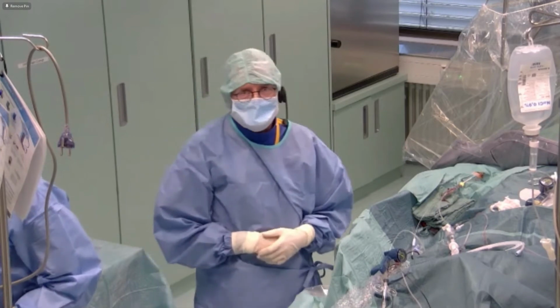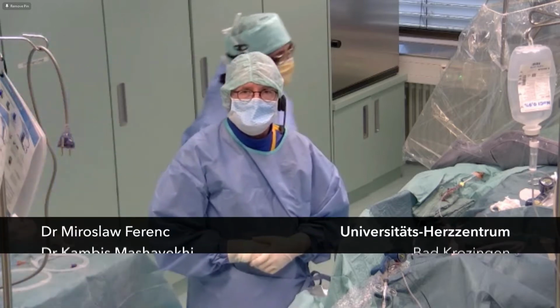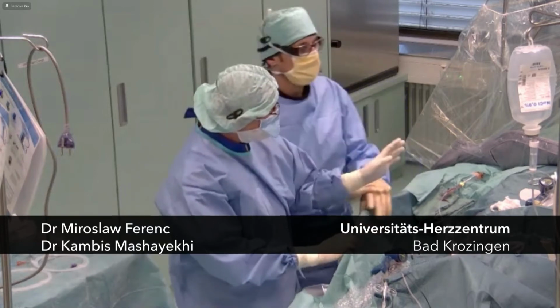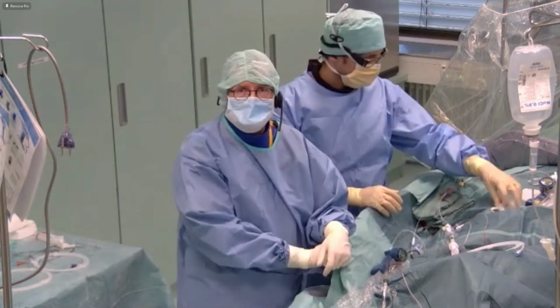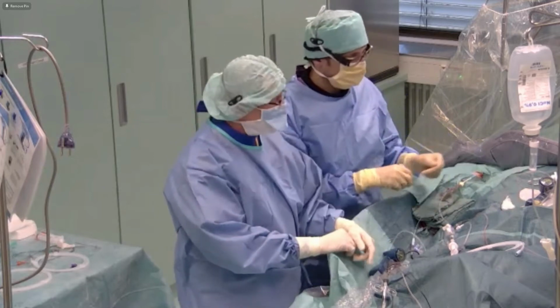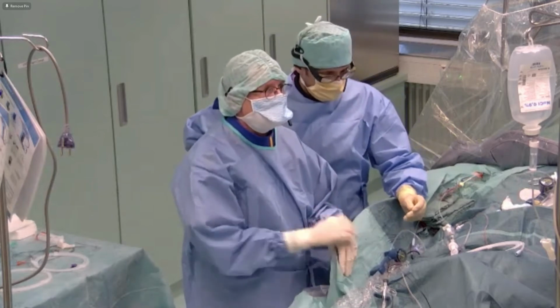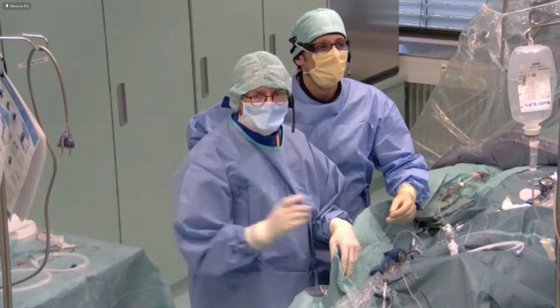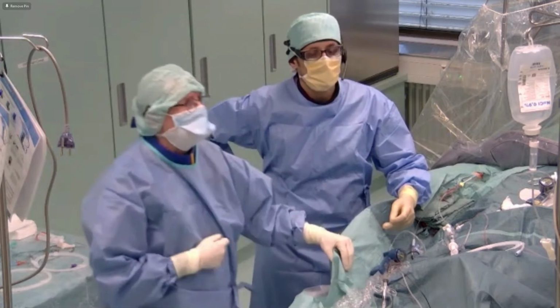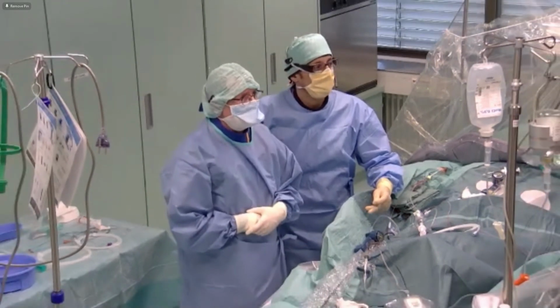So a very warm welcome to you, dear colleagues, from cath lab number 1 in Bad Krotzingen. We are here working with a very new system, the Siemens Icono, and with me is Kambis Mashayeki. He will perform this case. I will assist him and lead the conversation with you. And we have here as well Dr. Löffelhardt, who is responsible for imaging, and we have Sarah and Anya, two wonderful technicians.